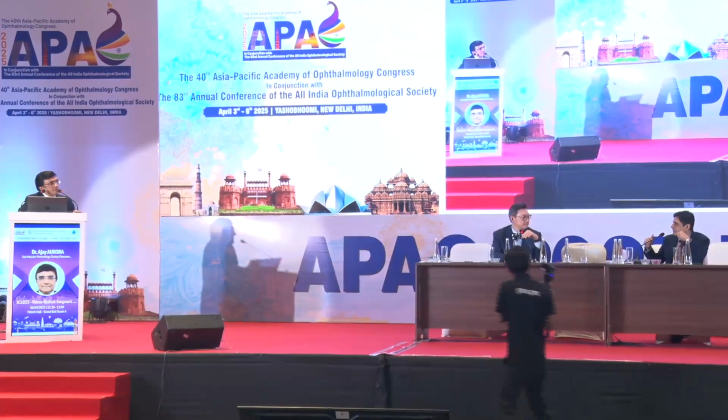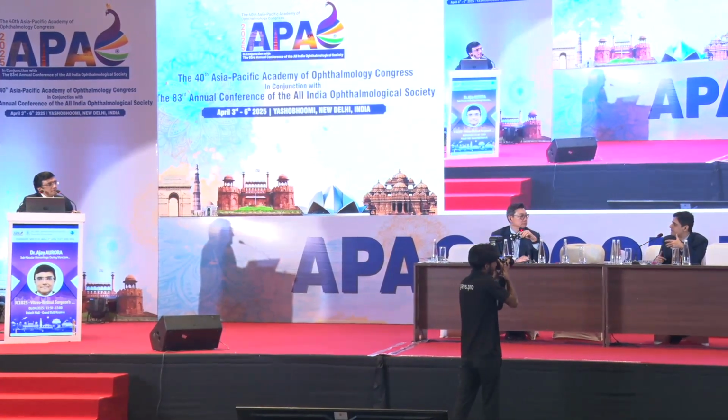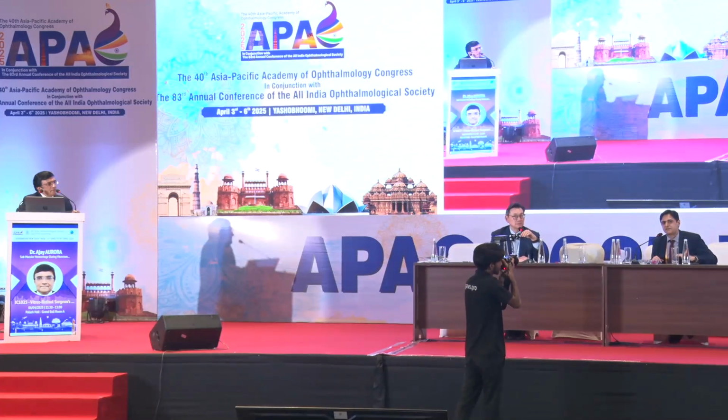So I have to make a comment. See, this is not like a diabetic bleeding. This is a submacular hemorrhage which is happening. So you can't leave the ports. I think you have to increase the pressure, but you have to be very careful that the blood does not seep underneath the macula. So the most important thing here is that we should prevent the bleed from reaching the macula. Immediately you should raise the bottle height, increase the pressure and put PFCL so that the blood stays away from the macula.